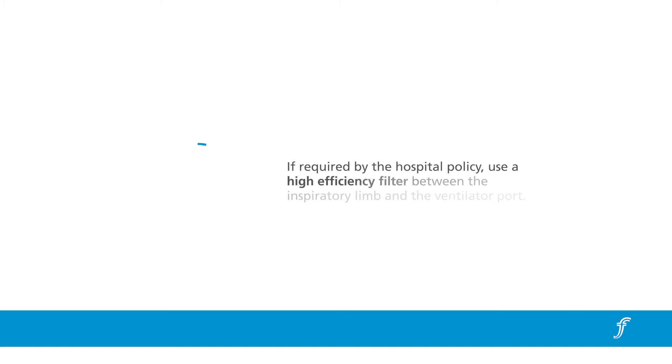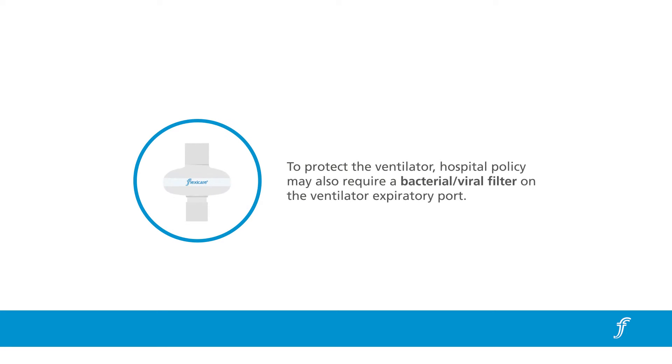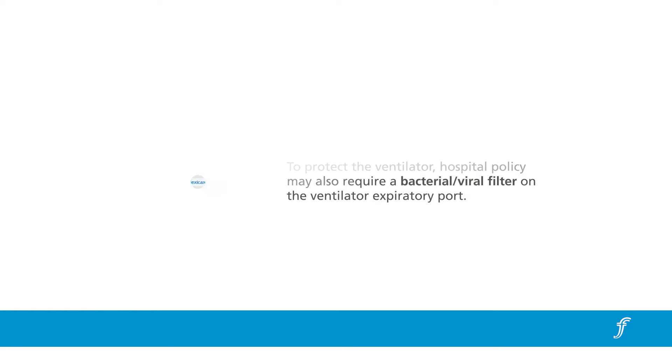If required by the hospital policy, use a high-efficiency filter between the inspiratory limb and the ventilator port. To protect the ventilator, hospital policy may also require a bacterial viral filter on the ventilator expiratory port.